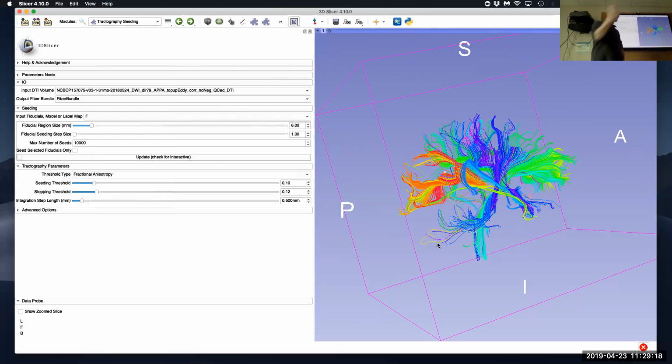That actually segues into my next section, which will be the atlas building and fiber analysis part. But it's a good question, and there are different methods out there in the field. Particularly, we have to first look at 2 things. Let me actually start up that next, because then I'll talk about all that. Any other additional final questions on this stuff?